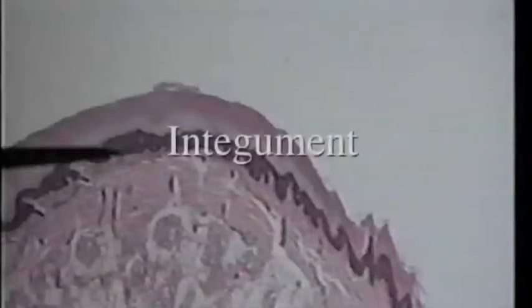We are back looking at thick skin again. Skin is composed of two basic layers, two general layers. The tip of the pointer is at the base of one. That layer is called the epidermis. The epidermis is familiar to you because we've already studied it as the epithelial layer of the skin. The epidermis is the most superficial layer of skin.